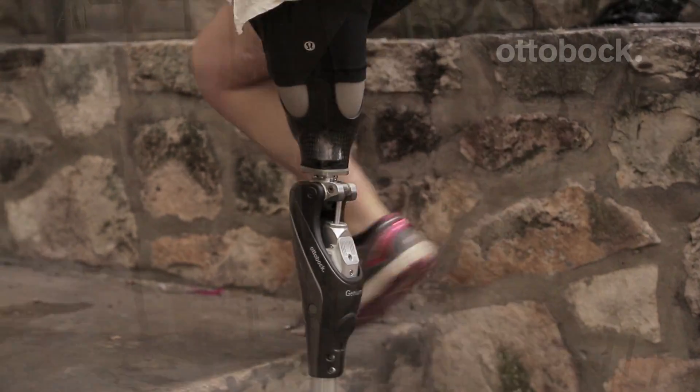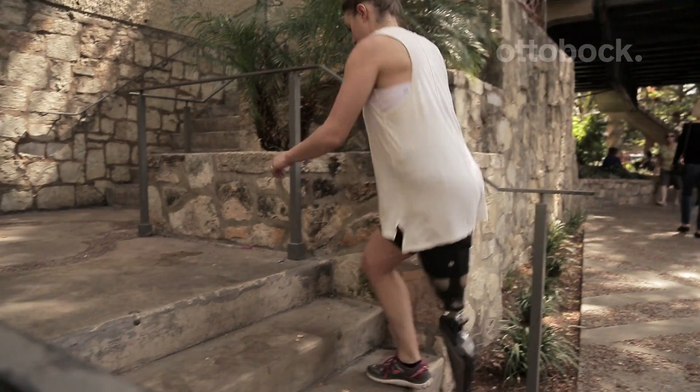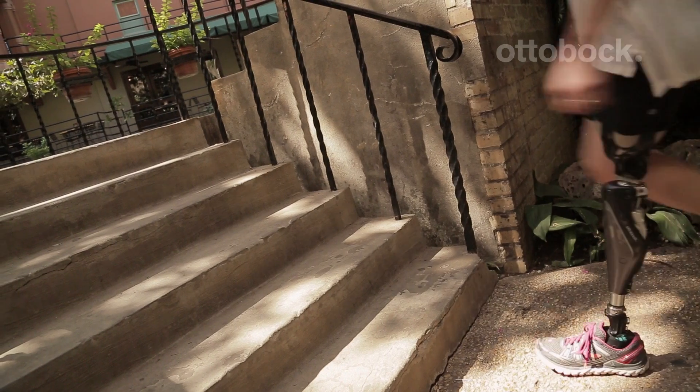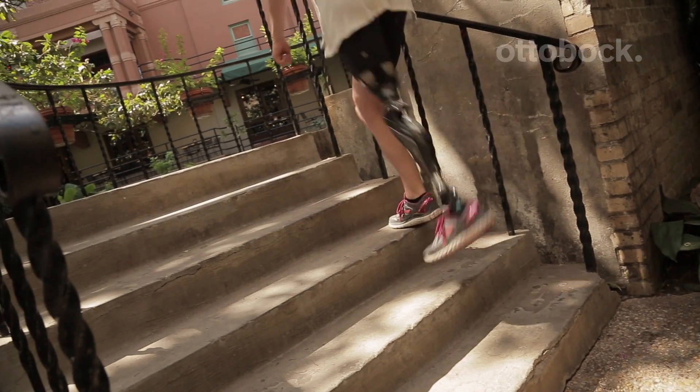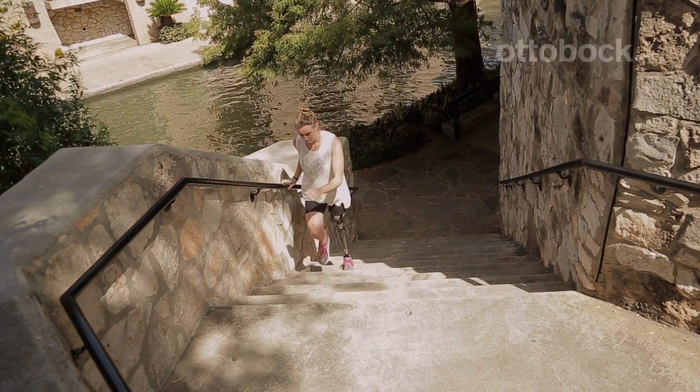What I'd like you to do is stand at the bottom of the stairs and put your hand on the hand rail. Load the toe with all of your weight. Slightly drag it backwards while then quickly driving your knee forwards and up. That will activate the step up.